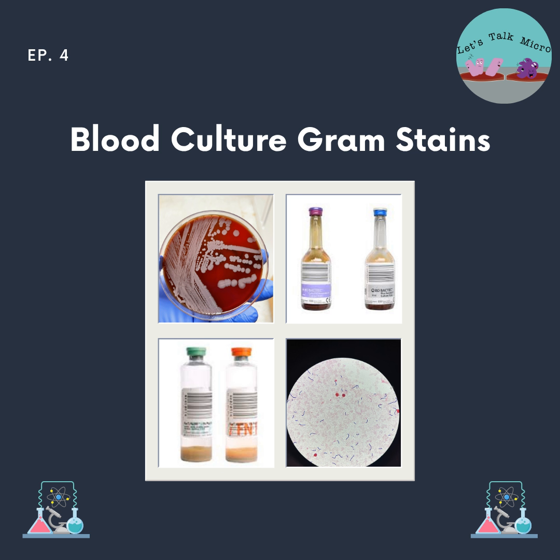Like I mentioned, I used to like the stronger decolorizer. And by used, I mean the facility that I work for doesn't use it anymore. Some techs didn't like it. They thought it over-decolorized, but to me, it was fine. You squeeze it, you get some on the slide, a good squirt, and it did the trick beautifully. It was just such a beautiful decolorization process. So I like it, but it's a matter of preference.